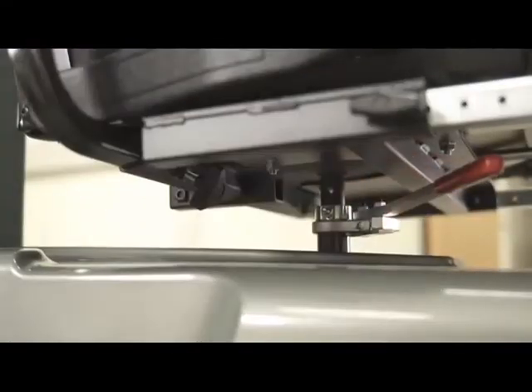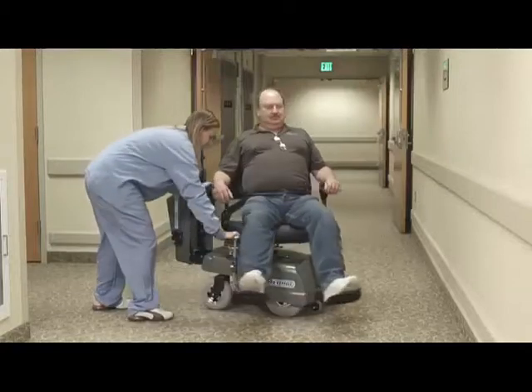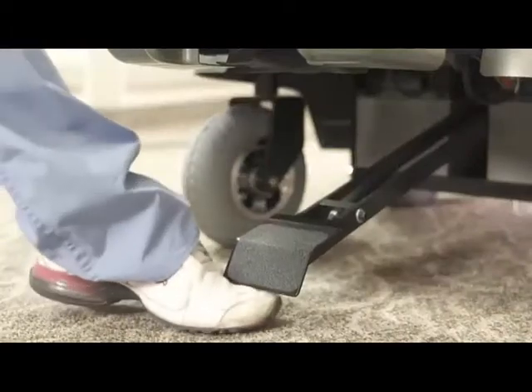Next, unlock the lever, then swivel the seat. Before moving the patient, make sure the seat swivels to its front position. Then release the foot lever.